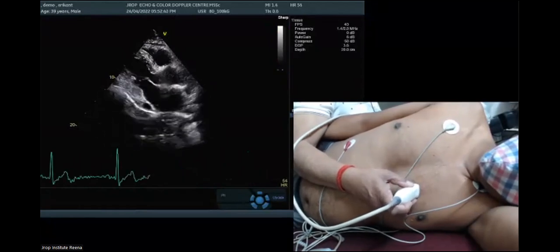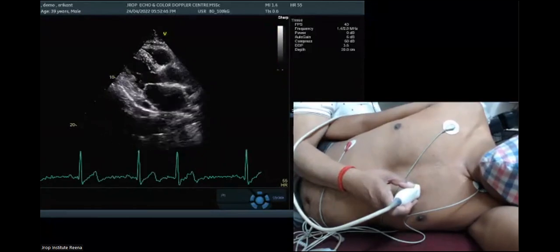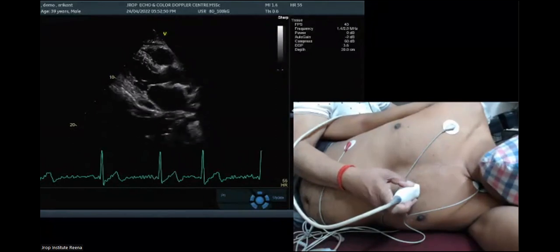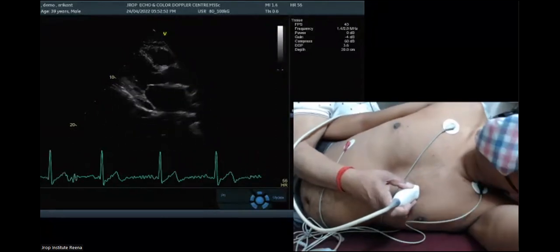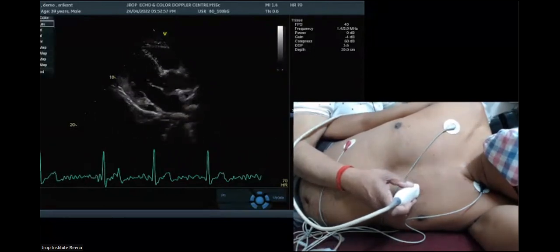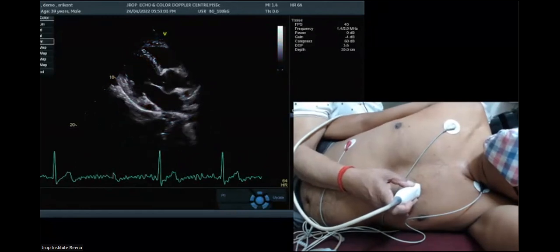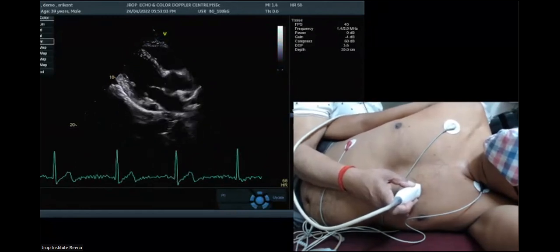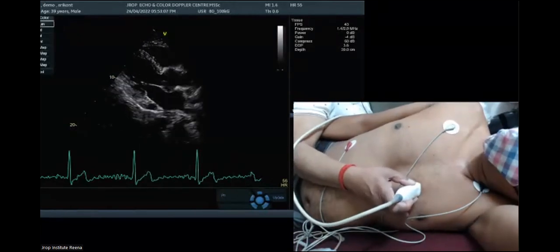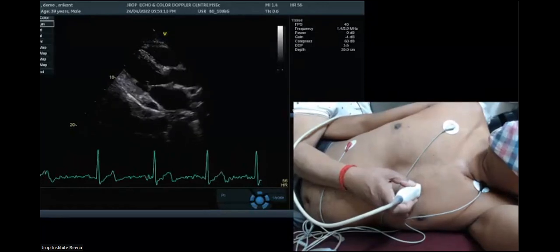And sir, the aorta itself looks so echogenic. Is it normal, or is it kind of sclerosed or calcified? What can we say? Now things have disappeared. I'm going to make it comfortable for you. Now it's no more echogenic. Yeah, much better. So it all depends on your hands. Look, this is a bright image, more echogenic. This is medium. So this is a normal image. Okay, sir. Thank you, sir.